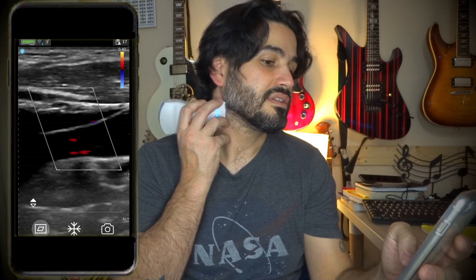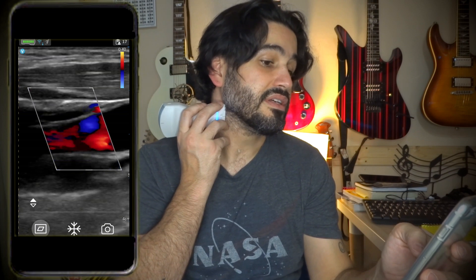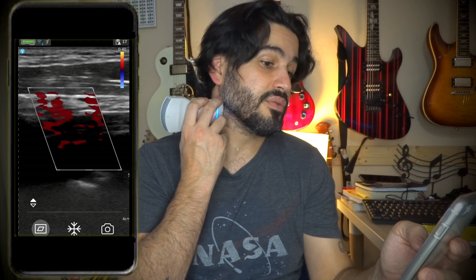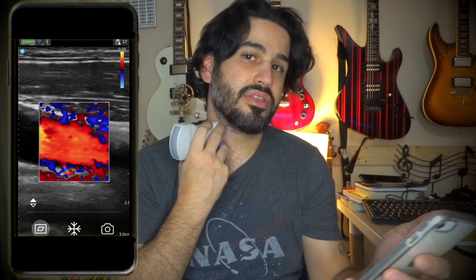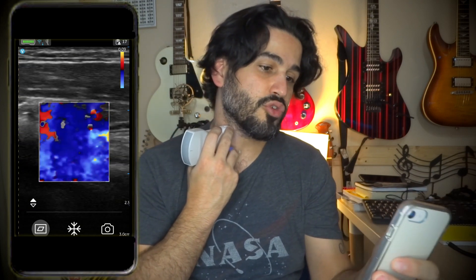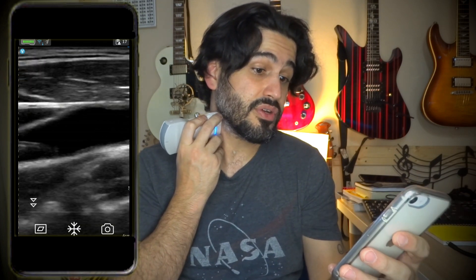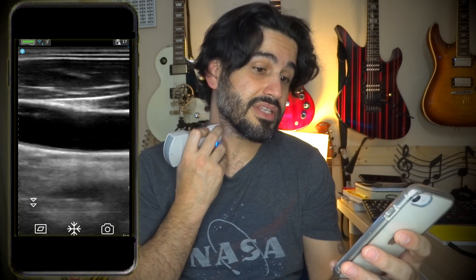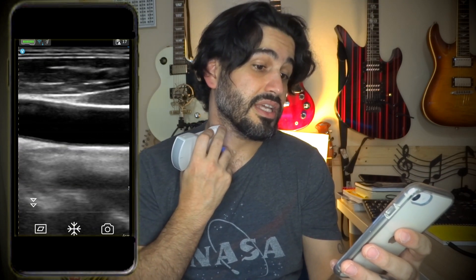I'm adding some TGCs because it looks like I have soft plaque in my ICA — but I don't; I've scanned myself before. Let's put the color Doppler on there. The only thing I've noticed with this color Doppler is that you can't steer it. I need to reach out to GE to see if steering is possible, because it's kind of annoying — otherwise you tilt the probe but sometimes you run out of space. Also, there's no spectral Doppler — no pulse wave Doppler on this probe.